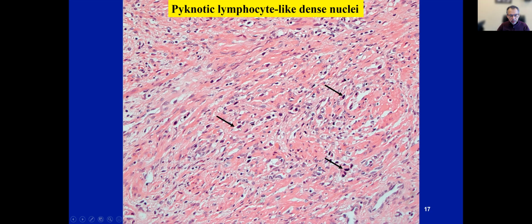But the correct recognition, and the clue that these are the tumor cells, is that they are dense, hyperchromatic, but very pyknotic nuclei. So if you apply markers in this particular setting, keep in mind that androgen deprivation therapy may show loss of some of the commonly utilized markers like PSA and NKX3.1.